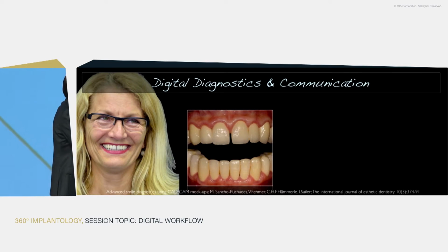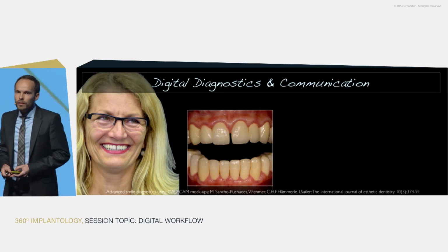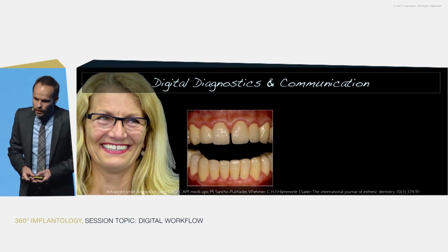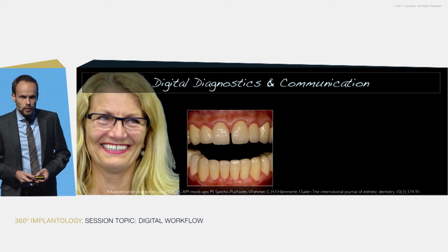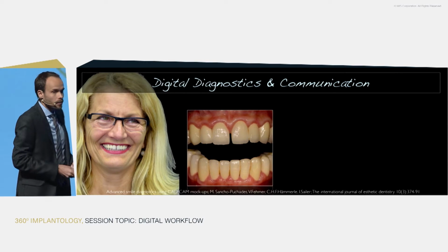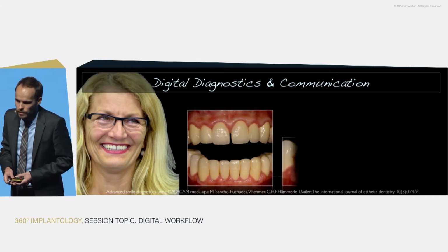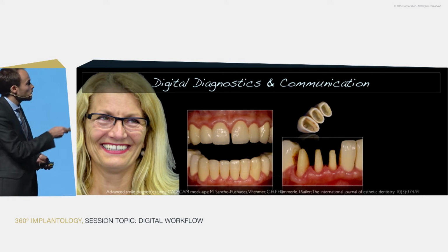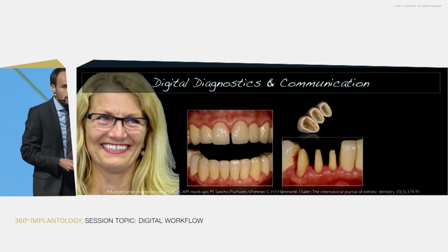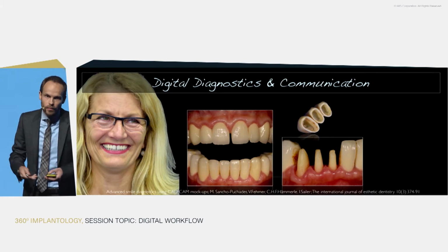The diagnostic aspect and the advantages of using this digital approach really come out with this patient that we had the chance to treat in Zurich. She went on holiday for 2 weeks and she returned with this new set of teeth. So far, everything looked fine for her. The only reason she came to the university was that she lost this 3-unit bridge in the lower anterior zone. She only asked us to please re-cement it, and she thought she would be back and everything would be fine.